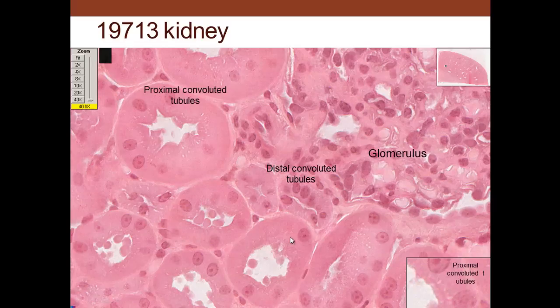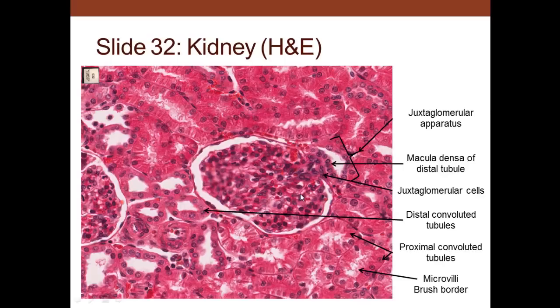The proximal tubules have a long distance between adjacent cells, as you see, where the distal tubules and nuclei are fairly close together. Proximal tubules have a brush border, only microvilli in the distal tubule. So here we can see the proximal tubules are very eosinophilic in through there. Distal tubules here. This is the vascular pole, distal tubule, Bowman space.